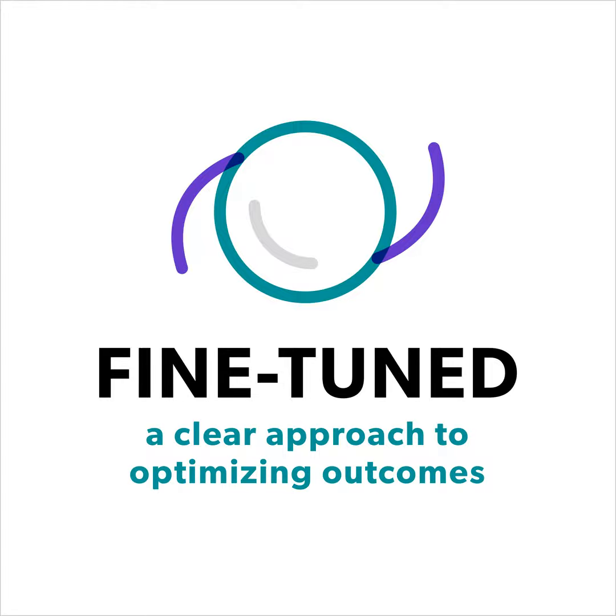Modern LASIK procedures take advantage of exceptional technology. Let's start with some of the improvements that you feel have been most impactful for patients and surgeons. There are a number of impactful technological advances. The use of femtosecond lasers for flap creation has reduced the incidence of flap complications dramatically compared to mechanical microkeratomes. This is especially true when looking at novice or inexperienced surgeons. Complications such as buttonhole LASIK flaps are rarely seen with femtosecond laser LASIK flaps compared to mechanical keratomes.